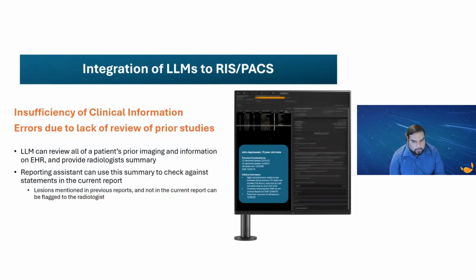In defense of all radiologists, it can be generally difficult when a patient has had multiple scans in the past to read through every scan and retain every detail before reporting the new study in front of you. Large language models are the perfect tools to create summaries for us of this information, and they can read this information so quickly that we can almost have it generated for us live as we open the case.